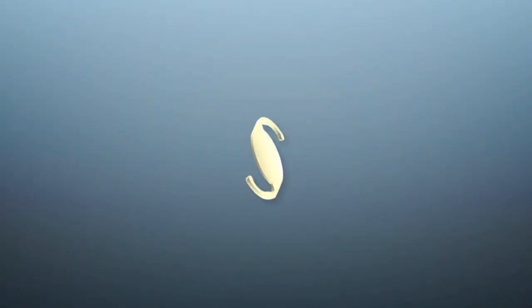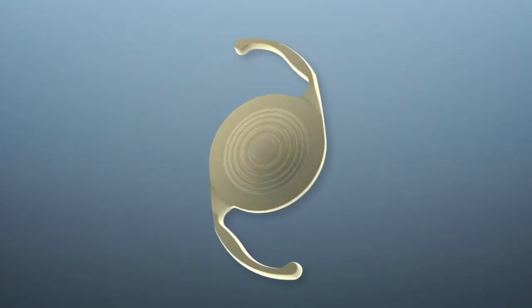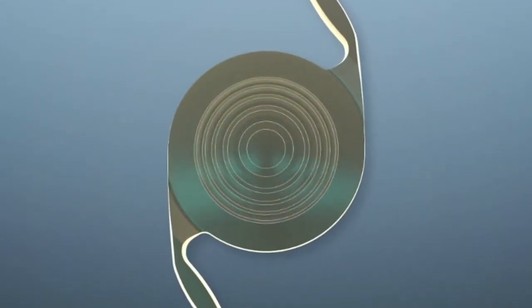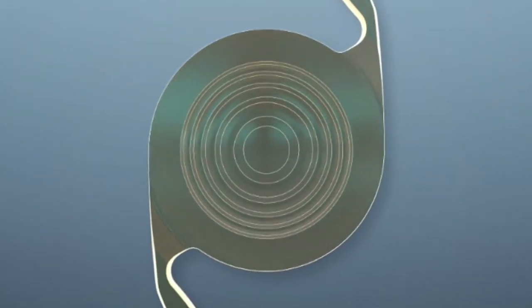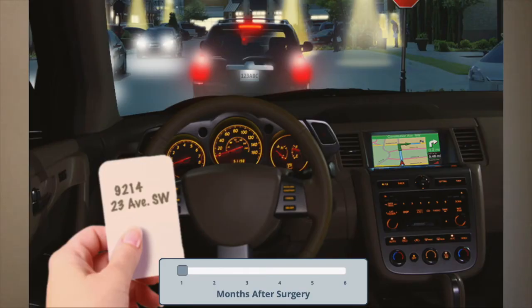One of the downsides of multifocal lenses is the way they work is by having rings in them. These rings split the light, allowing you to see the vision at multiple distances. However, they do create some rings or halos in your vision. These are mostly at night, such as around oncoming headlights. Most patients have them to a moderate to even a pronounced level for 1 to 3 months after surgery. They then usually go to a much lower level over time. Some patients have a full resolution, but the majority of patients do have permanent but mild glare and halo around lights.